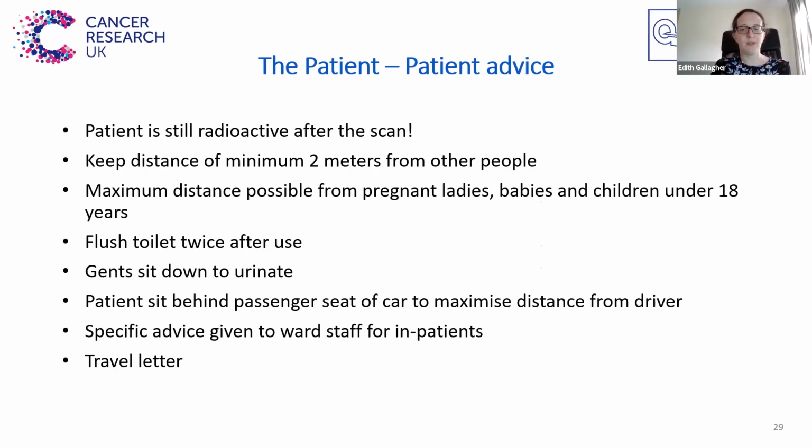And one other big difference from CT and X-ray, our patients are still radioactive after they finish the scan. General advice to patients will be about keeping their distance from other people. However, at the moment, everybody is doing that.